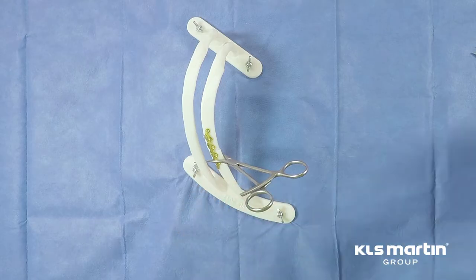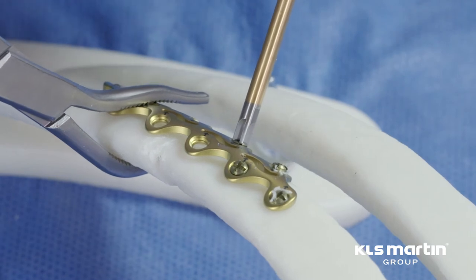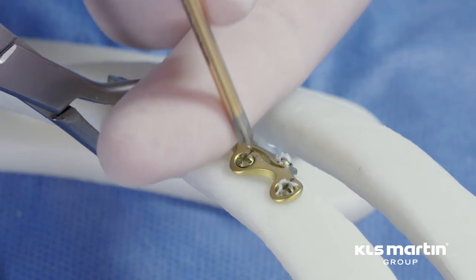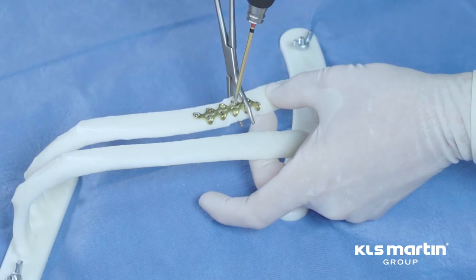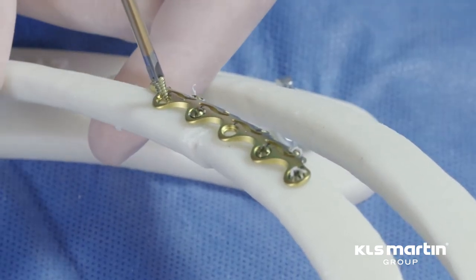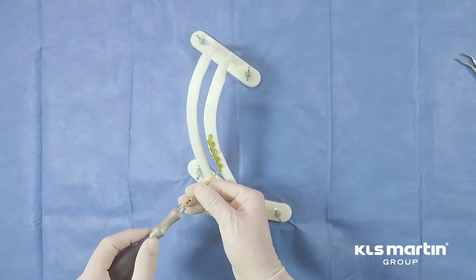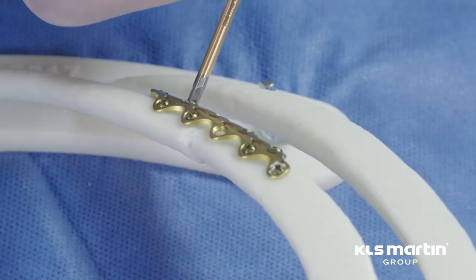It's not infrequent to have to add a little bit of torque to ensure that the plate and the screws are locked together. That's done easily with this manual driver. Only gentle pressure is required to advance the screw, and that limits the risk of losing your reduction. I am confirming the locking mechanism and guaranteeing that the screw is locked to the plate.